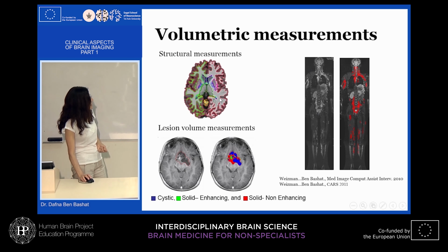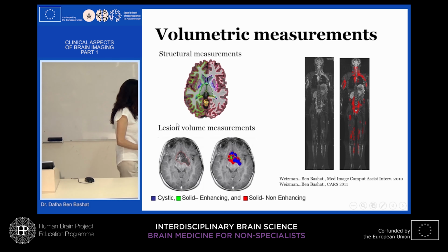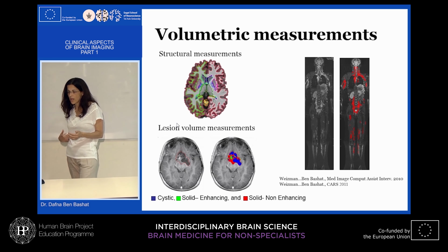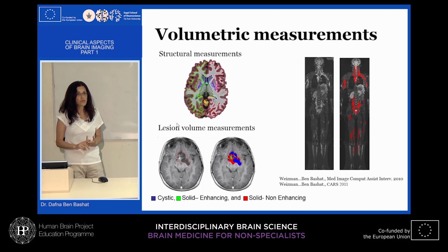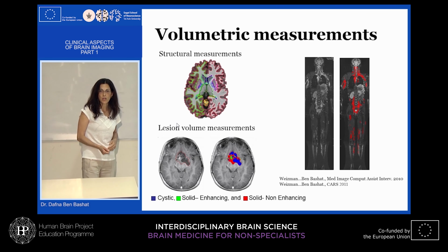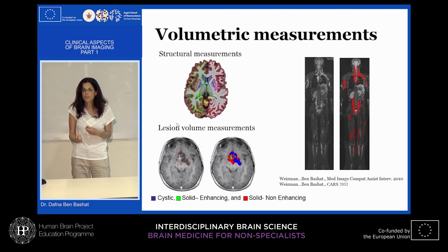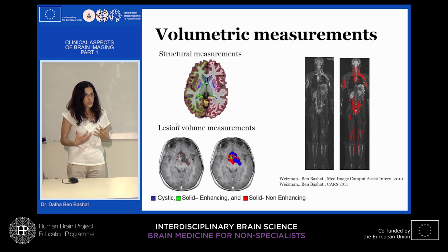We can go further. There are a lot of freely available segmentation tools, and others from companies for money, that take an adult brain and segment it into different structures. The problem is that most of those tools do not work on small babies because they assume a large brain, and they also don't work when there is pathology. In my study on children with cerebral palsy, where half of the brain is a big lesion, none of those tools worked, because they assume a normalization template, and there are specific tools.